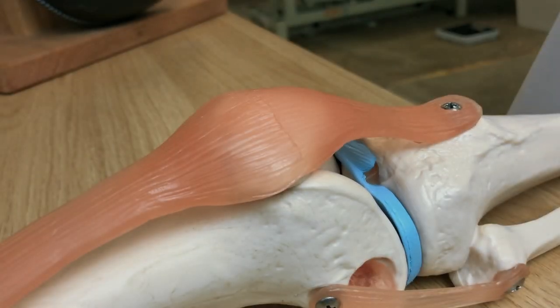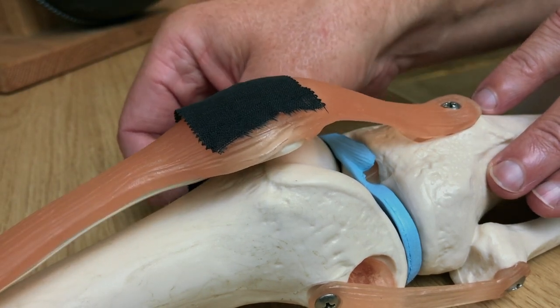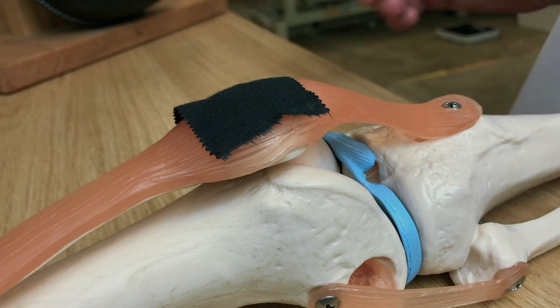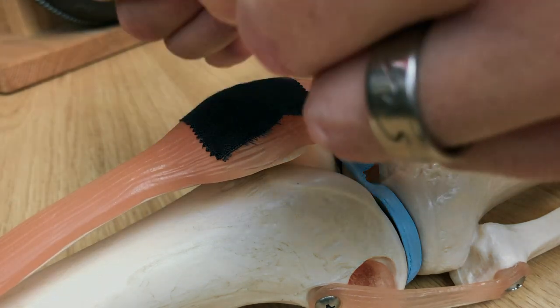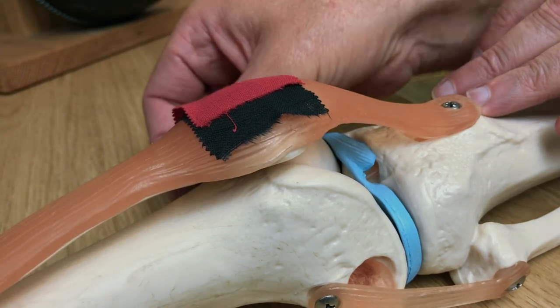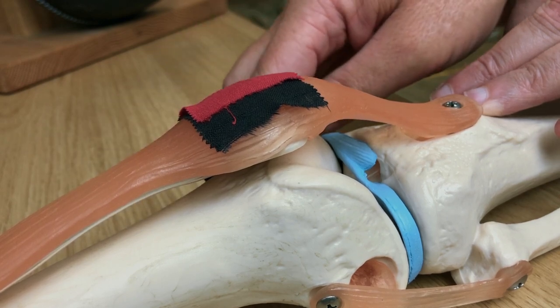Let's have a look at what the three pieces of tape are actually doing to the kneecap, using the model to make it clearer. The first piece of tape applied over the kneecap drags the kneecap medially, and you can see this starts to open up the space between the kneecap and the underlying bone. By starting the second piece of tape halfway across the kneecap, we produce a tilt in the kneecap, and again more space is made underneath.